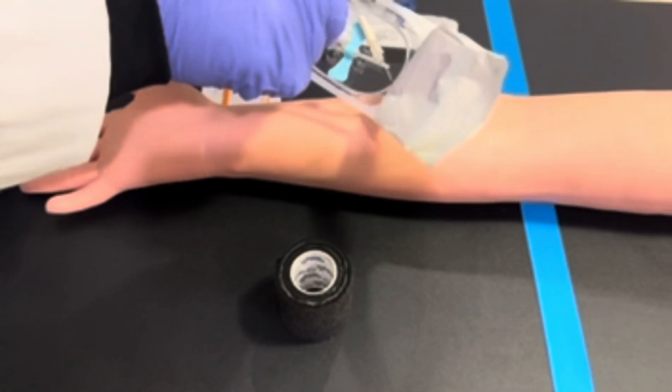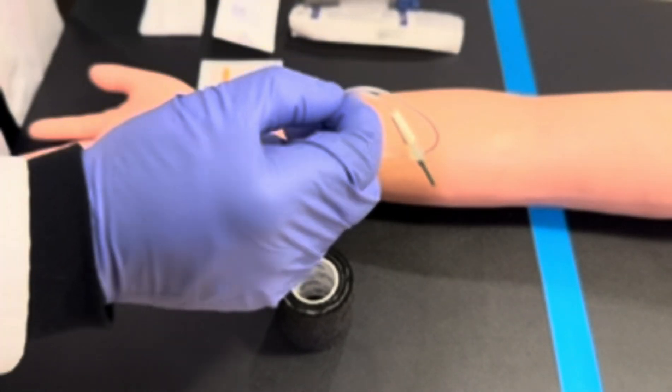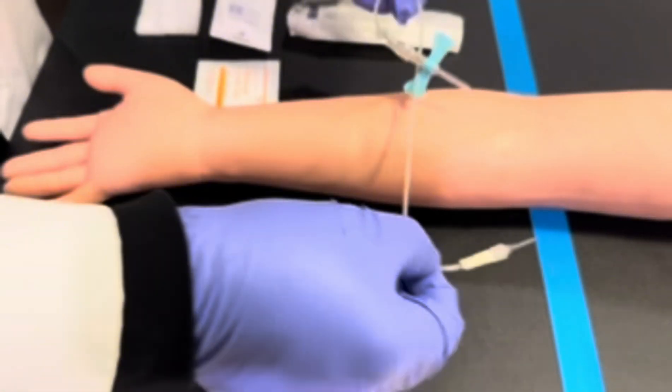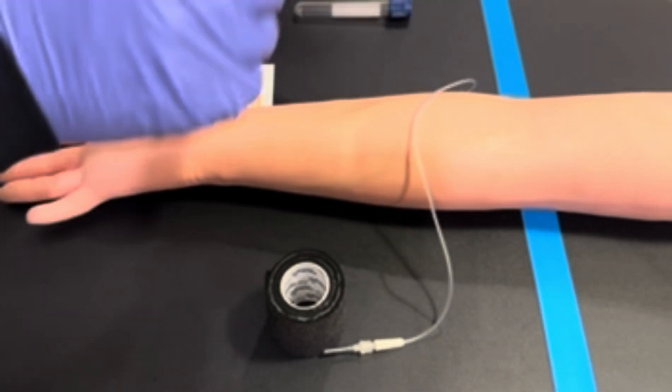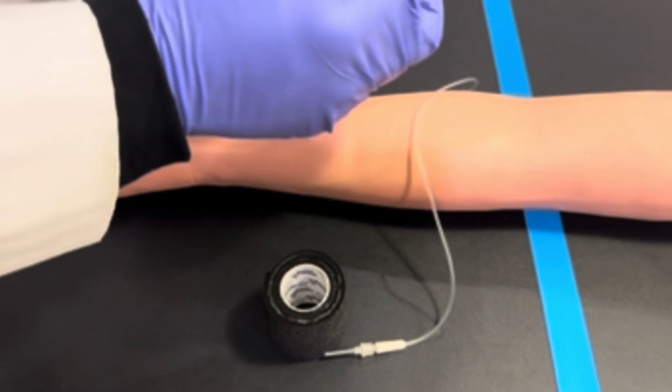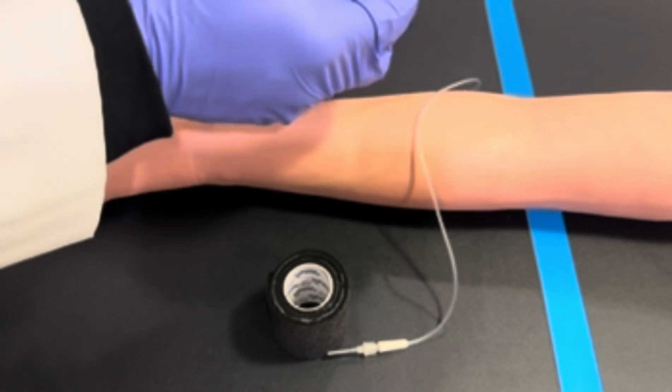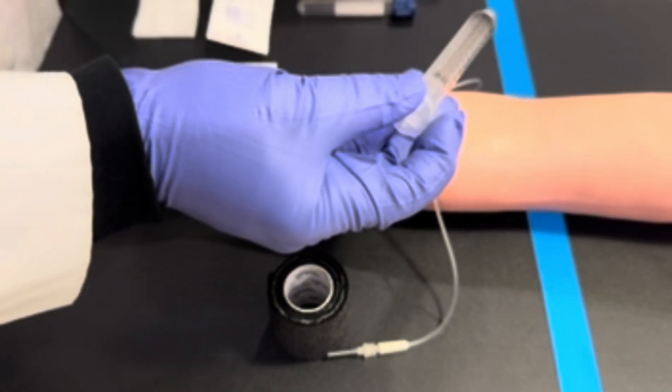We're going to use a 23-gauge butterfly for this procedure. When you're utilizing a syringe method, first you have to assemble the butterfly needle and connect it to the syringe.